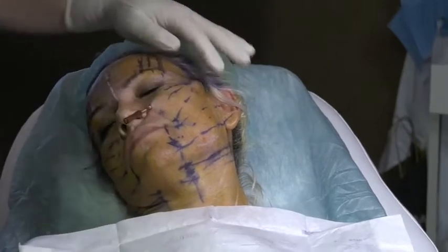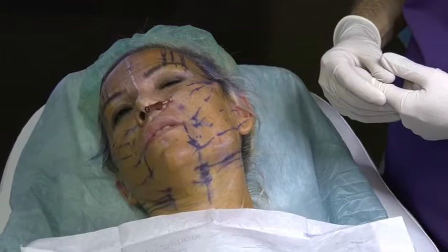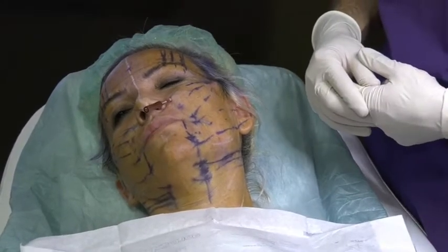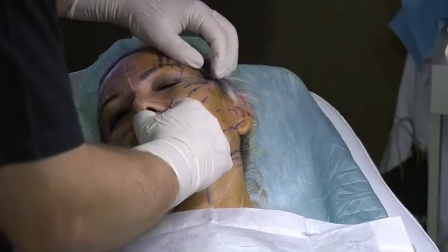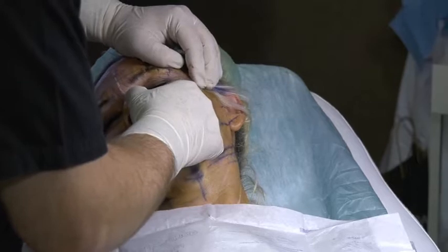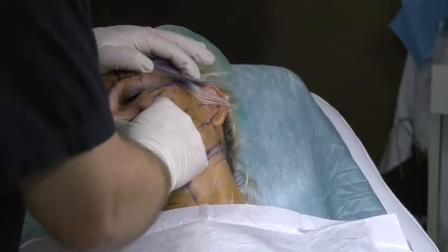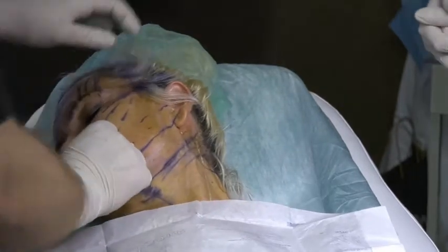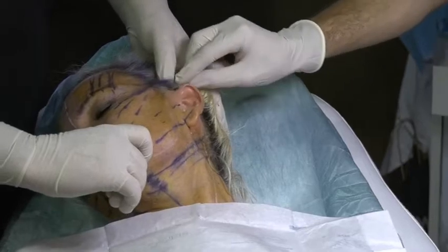Okay? And each time I check if I am in the proper direction or no. If I am in my line or no. Okay? I have to check every minute, every drive. Press hard. Sorry, madam. You have to be careful. Patient with me. I finished number 1. Thank you. Look where I am. Do you see where I am? Okay? I went on to the temporal zone.